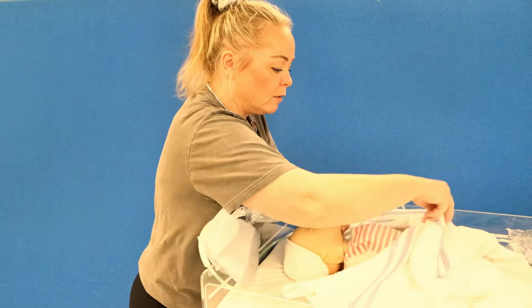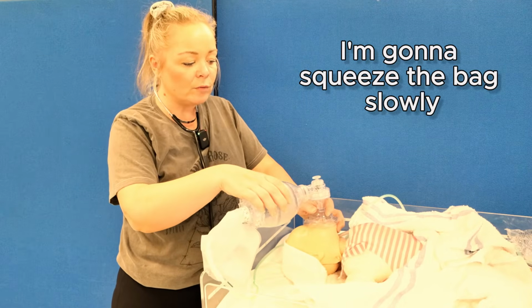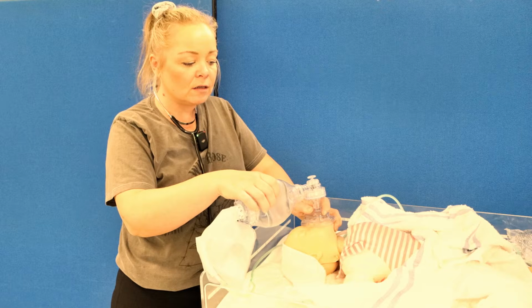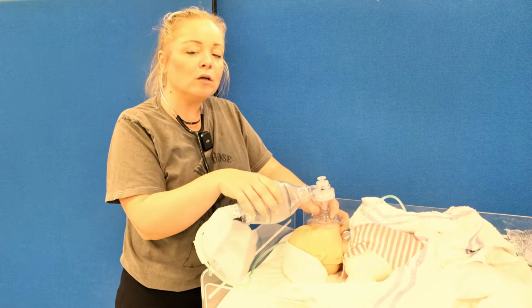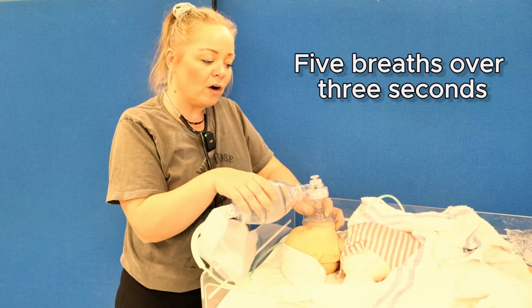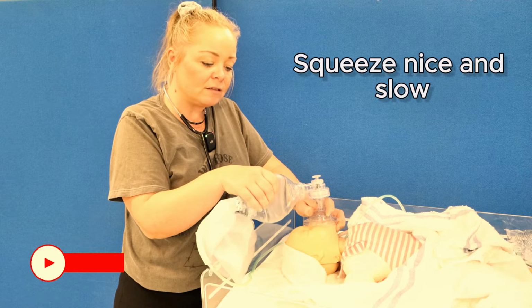I'm just going to move this towel down a bit just for observation purposes for you guys to see. I'm going to squeeze the bag slowly to do my inflation breaths. Over 3 seconds. I'm going to do 5 breaths over 3 seconds. So you want to squeeze nice and slow.